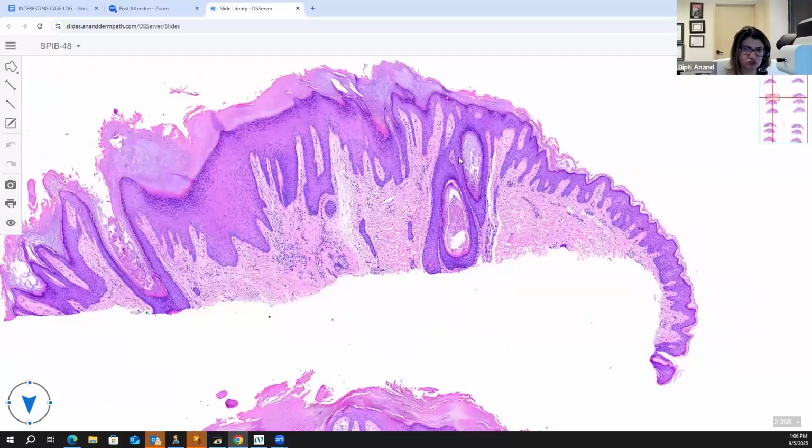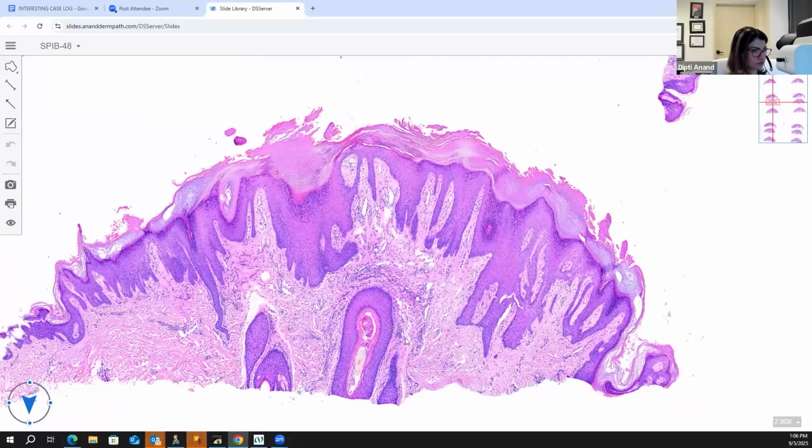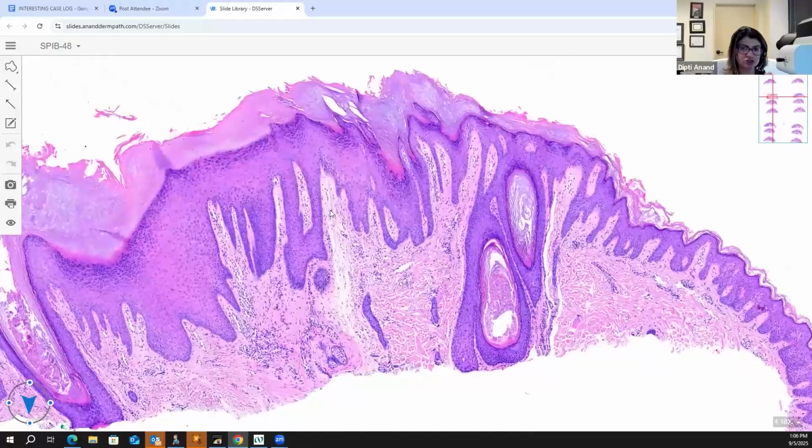But then what are these hair follicles doing? You see the hair follicles? This one here and this one here. Look at how fat they are. Yeah, definitely. So that is the diagnostic feature. The other diagnostic feature, and I want everybody to notice this, you see the vessels, how they are vertically oriented? They are pushed up. The fibers and the vessels are pushed up. This pattern of fibrosis and vascular arrangement is classic for chronic friction. Robin.